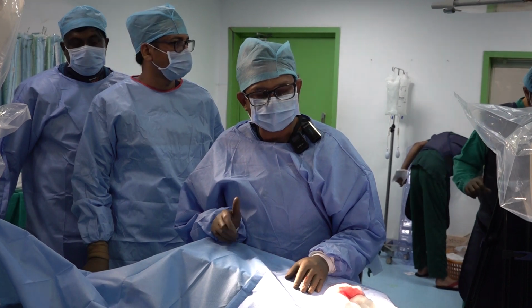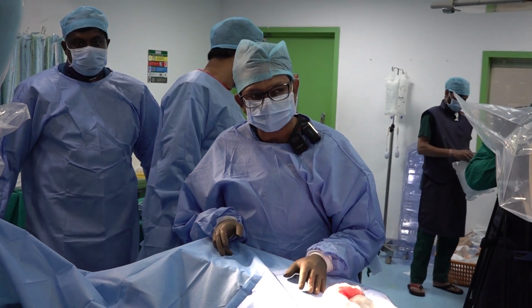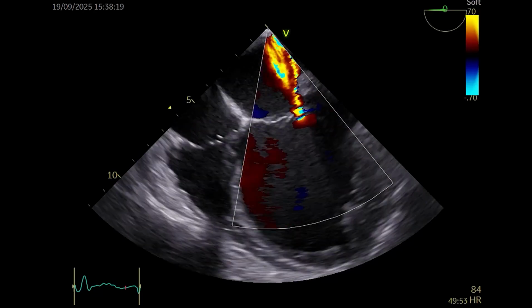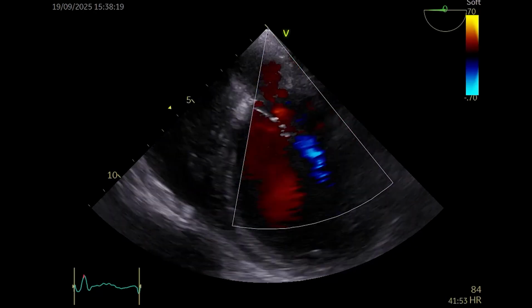We have recorded the echo for you, and Dr. Hemant is going to describe it. So Dr. Hemant, please describe the echo. We can see a very similar landmark. You can see the PML is restricted.